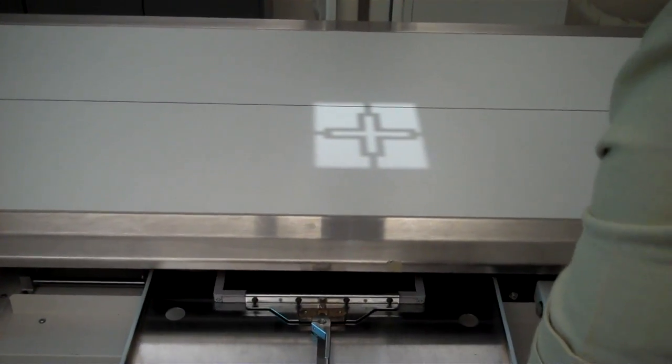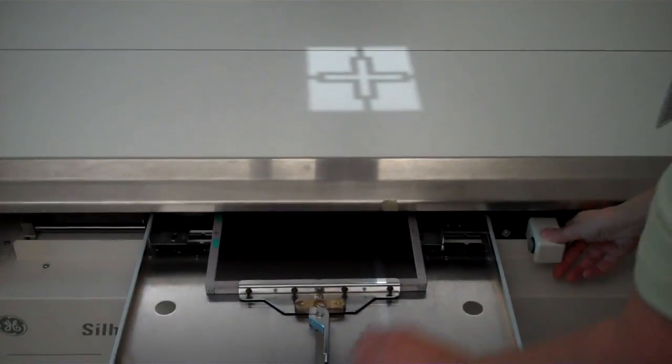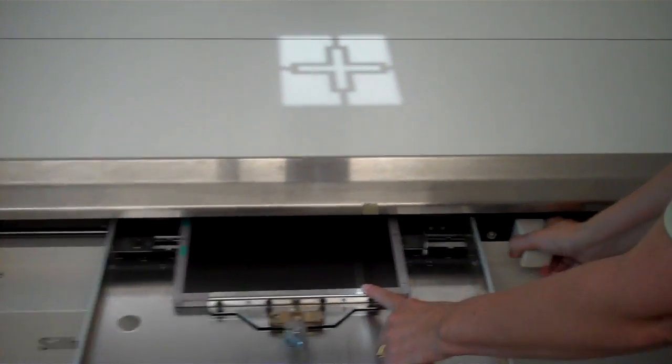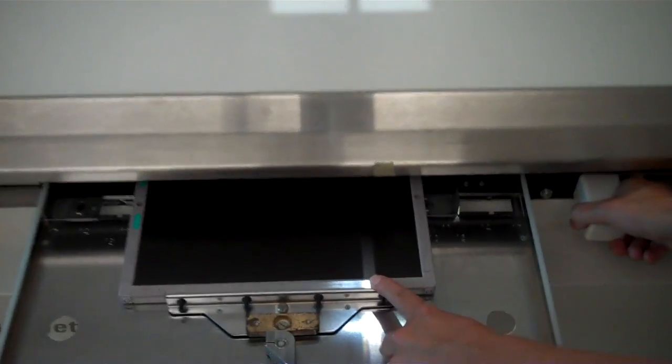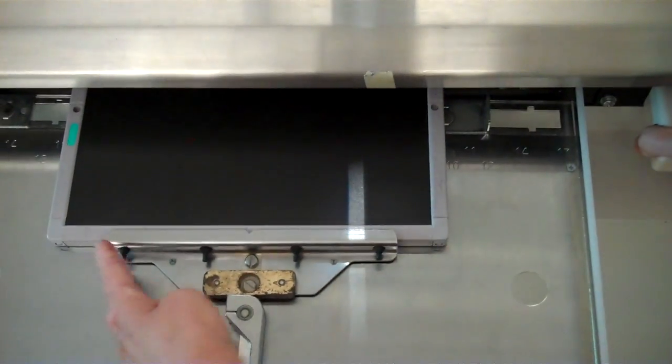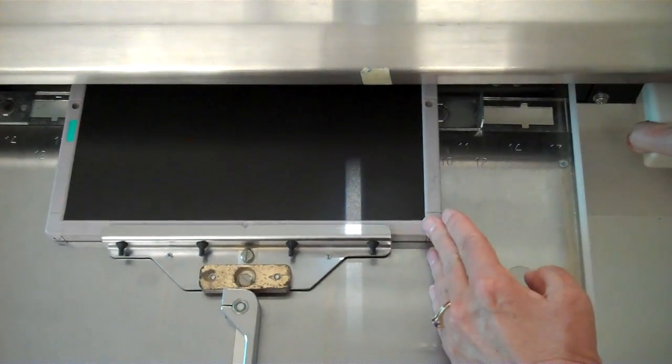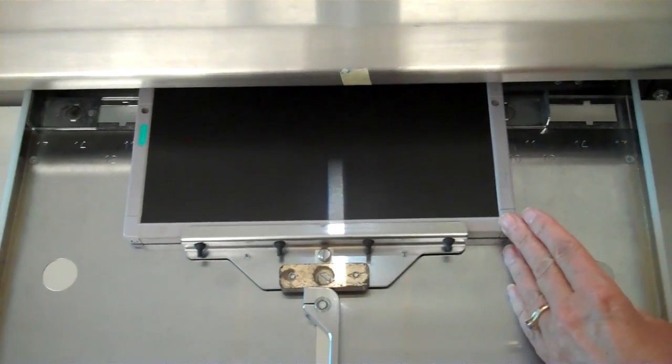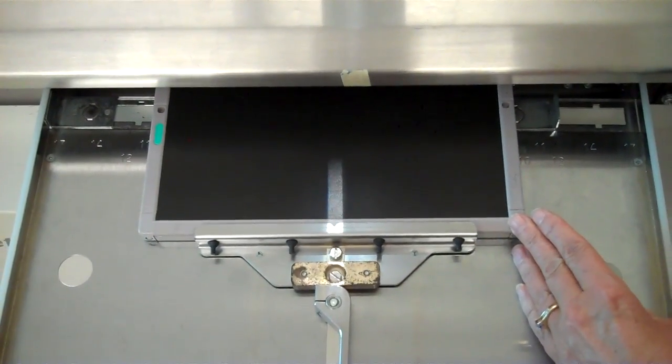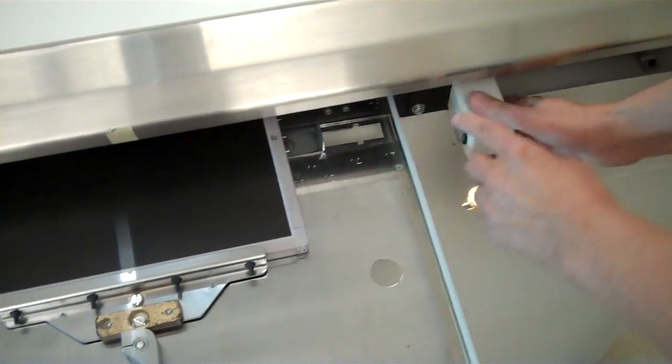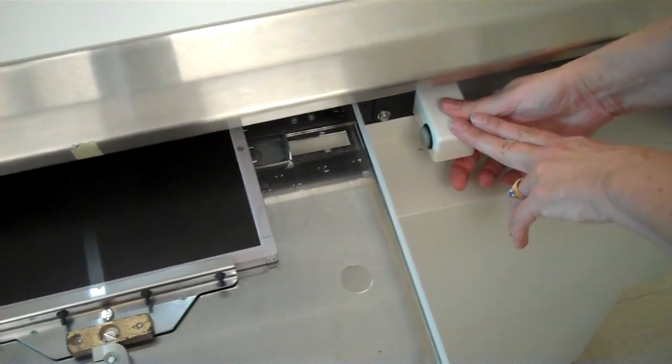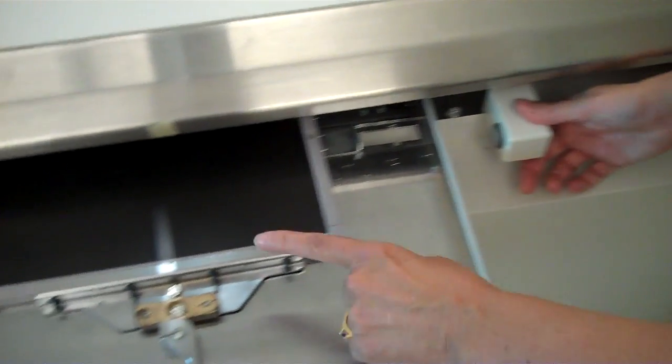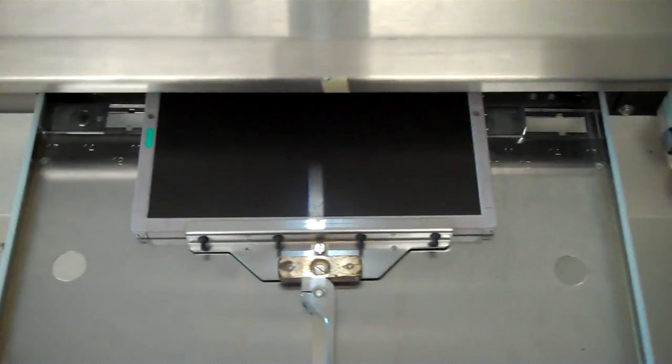As you can see, there's a light and we're not from the top of this image receptor to the bottom of the image receptor aligned. We're going to move the image receptor with the lock that's here on the side for alignment.